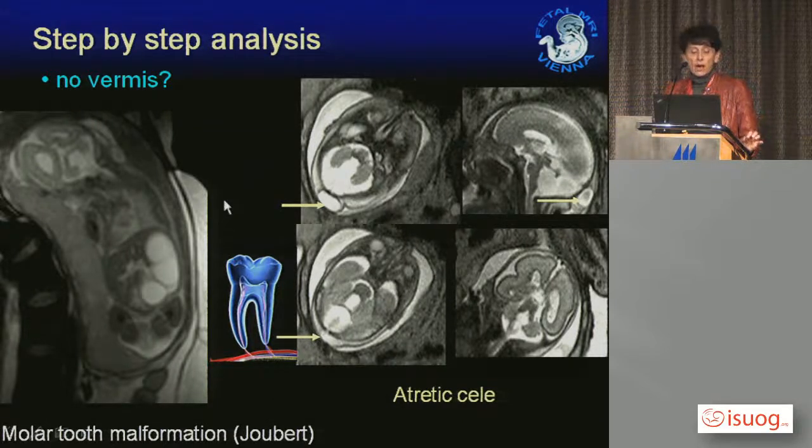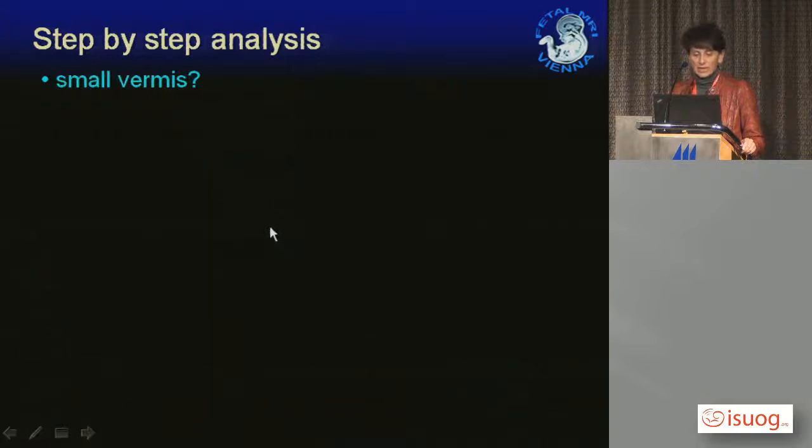Usually, you know how we get these patients. Well, we get them because of the kidney situation. So it is really important for us to look at the whole fetus and not only at the kidney, because the main diagnosis would have been missed.